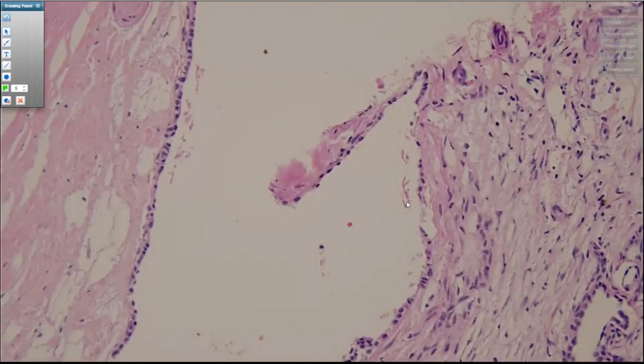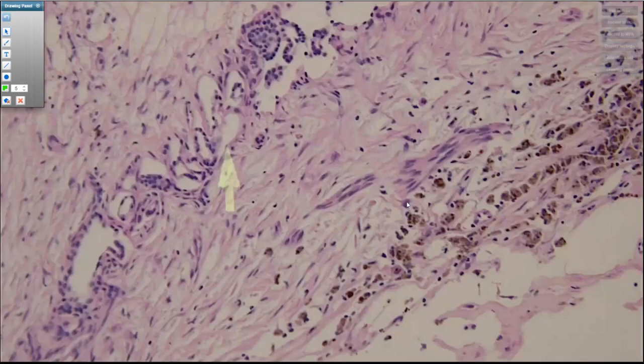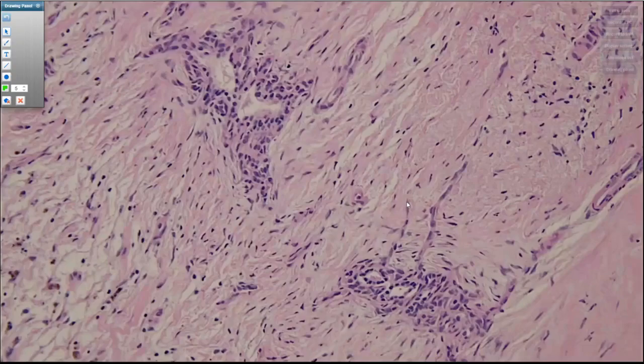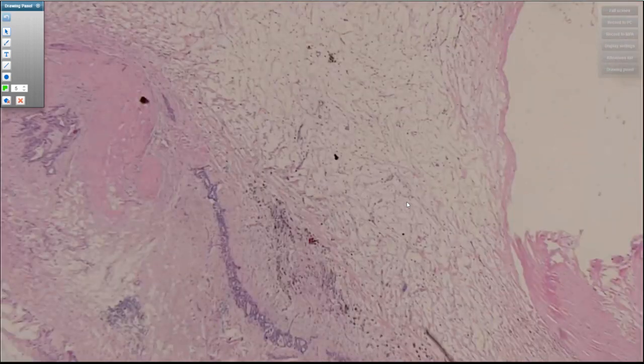So here's a larger cyst area. The cells look a little bit rounder, and you can appreciate maybe a little bit of clearing to the cytoplasm. Again, that should help clue you in to the diagnosis. But it can be very tricky if most of the cyst is gone, obviously. A keratin can help highlight the epithelium that's there, if it's really obscured by all the inflammation, at least to help draw your eye back on the H&E to where you need to look.